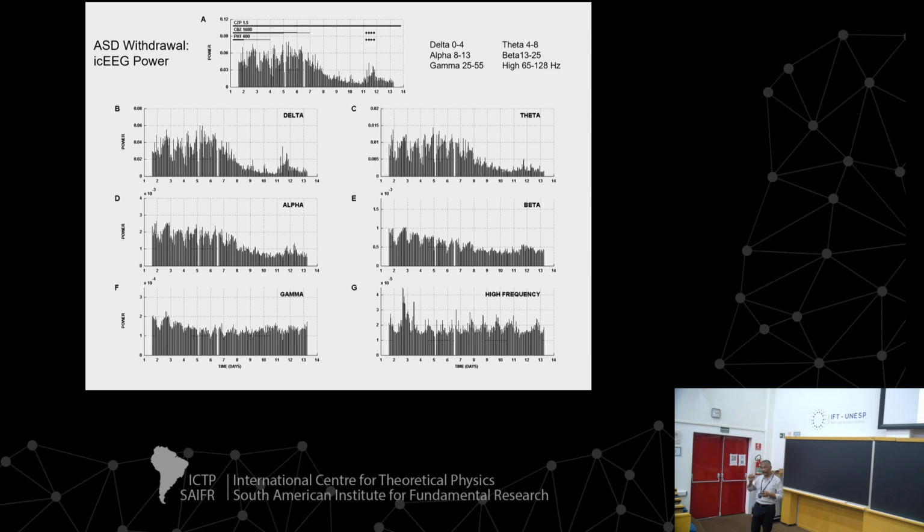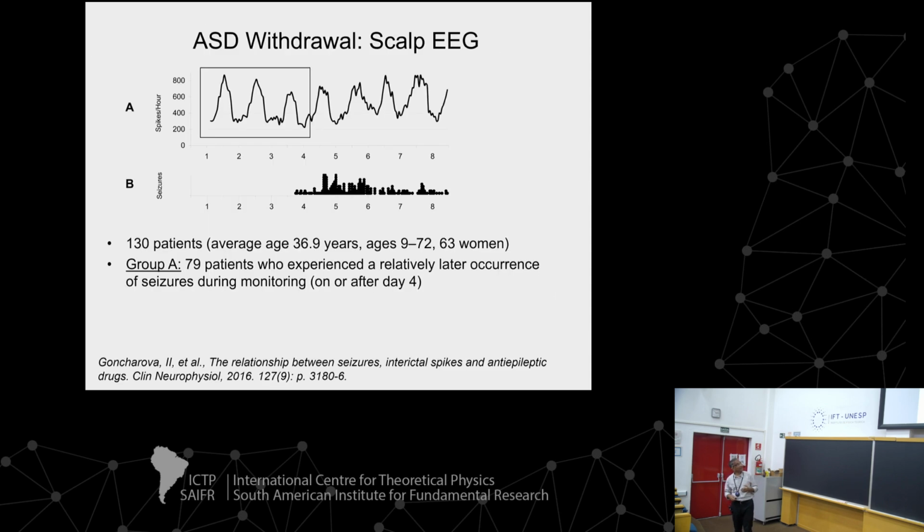They're periods of high non-stationarity and very complex dynamics, and I wanted to first understand what's going on in the brain if I were to step back and just look at the ongoing activity. This is not really spikes, these are just traditional spectral measures. I've taken the data into the Fourier domain and decomposed it into power in different frequency bands, from low to high frequency. But essentially, what we're seeing is this broad band decrease.